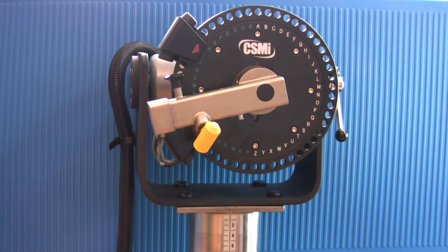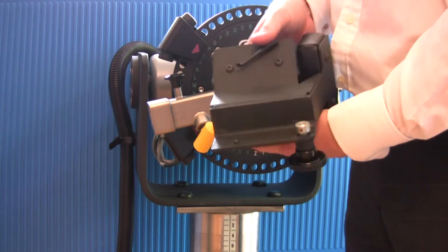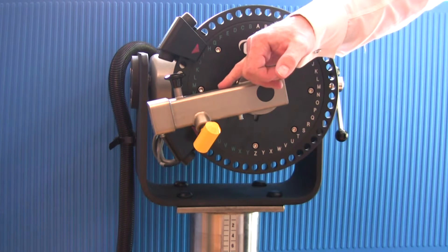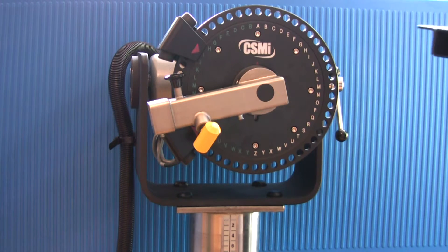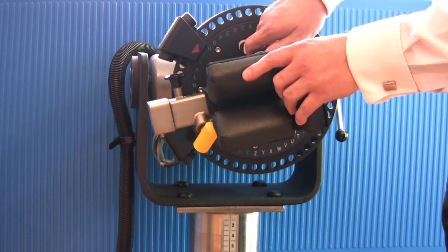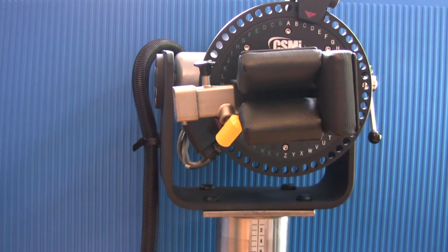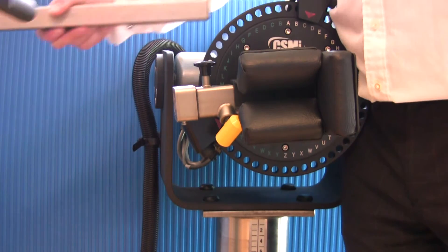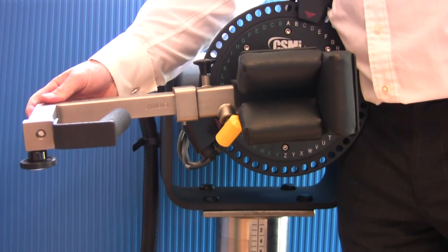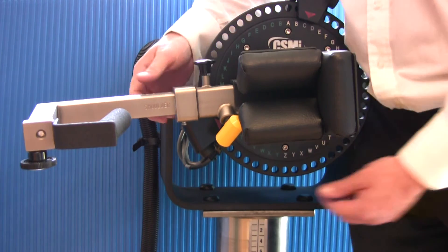Install the elbow stabilizer pad onto the short end of the input arm first. Line up the screw with the groove and insert. Secure with the locking screw. Then install the wrist shoulder adapter into the long end of the input arm. Ensure the handle faces away from the dynamometer face. Pull the locking pin to allow full installation. Secure with the locking screw.